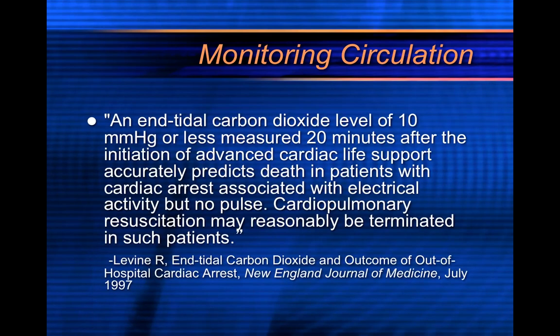So check for a pulse with a sudden drop or a sudden increase, because the sudden increase, for your cardiac arrest patient, you can check for pulse, check for ROSC. And the sudden decrease in end-tidal CO2 could be an indication that you lost a pulse.